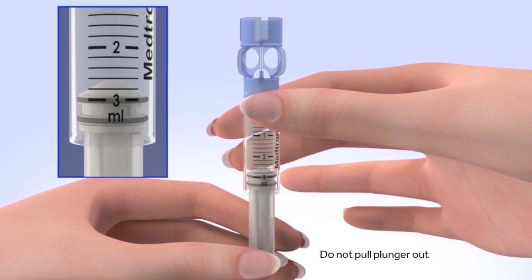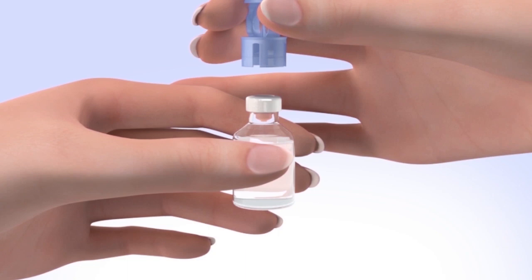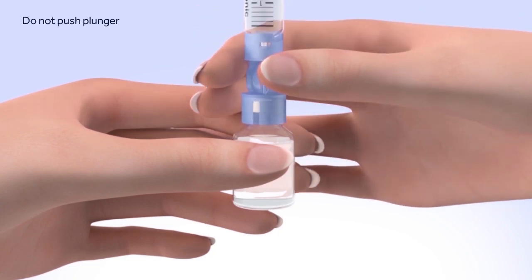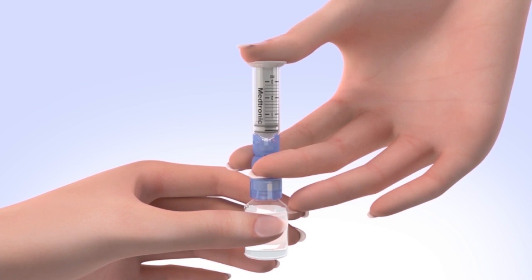Be careful not to pull the plunger completely out of the reservoir. Hold the reservoir by the blue transfer guard and connect it to the insulin vial by pressing down. Be careful not to push down on the plunger during this step. It's very important to push air into the vial before taking insulin out. To do this, keep the insulin vial upright, place your thumb on the plunger, and firmly push the air from the reservoir into the insulin vial. Continue to hold down the plunger with your thumb.